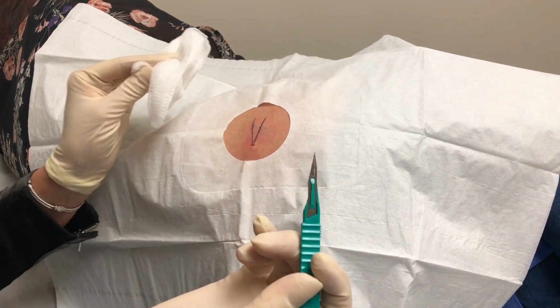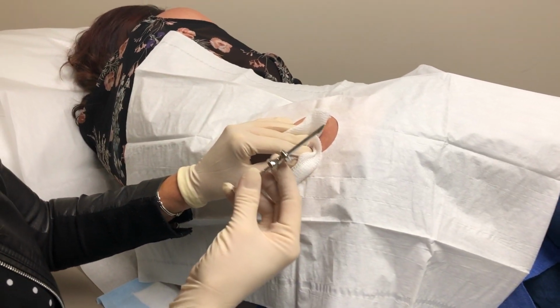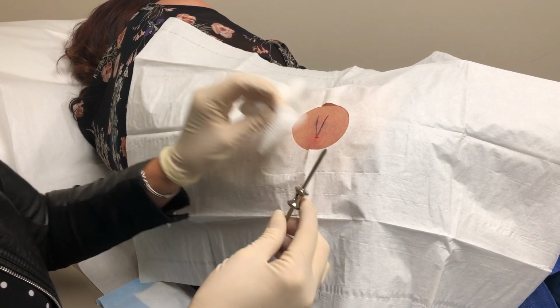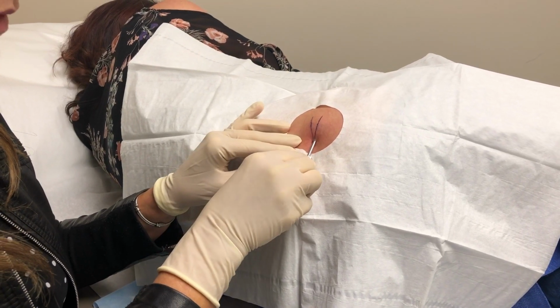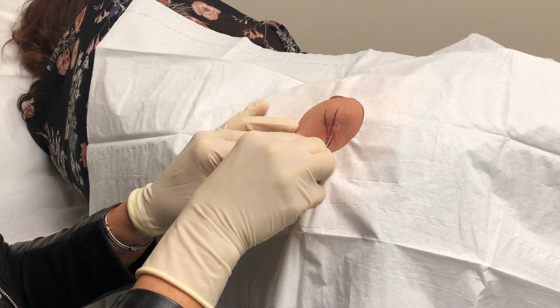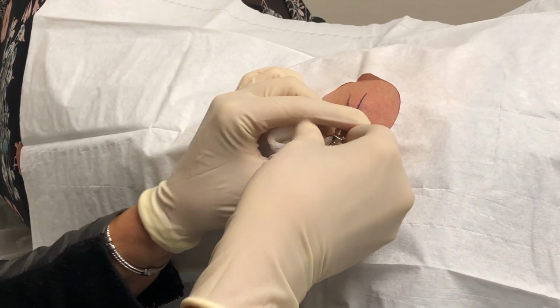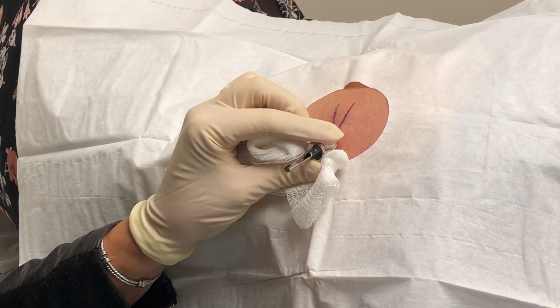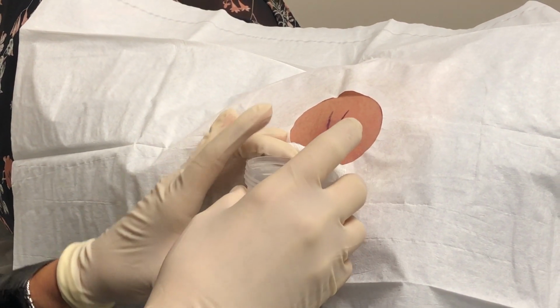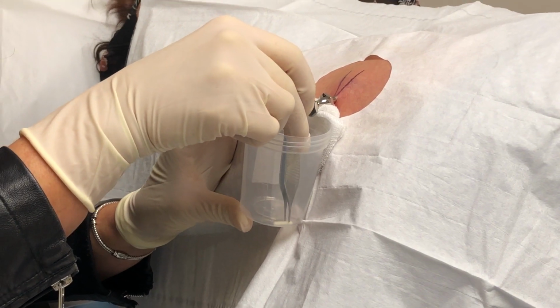So just make a tiny stab wound, that's about 3 millimeters. And then we take a sterile trocar that has a sharp end on it in order to find the spot for that pellet. And this just goes underneath the skin. Lots of pressure, Lynn. Are you doing okay? Mm-hmm. And then that pellet just gets put in this empty track here.